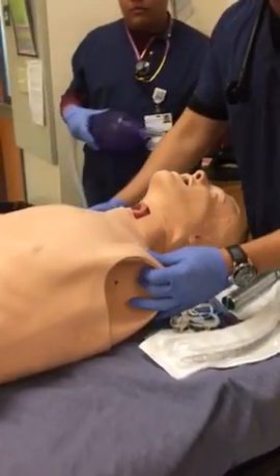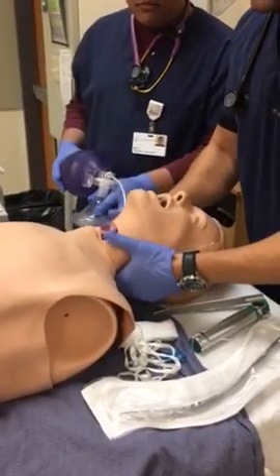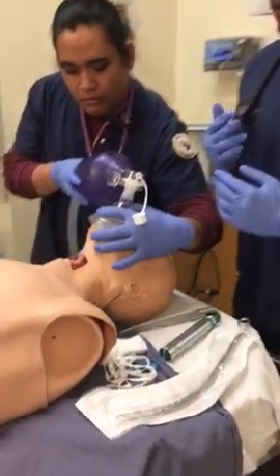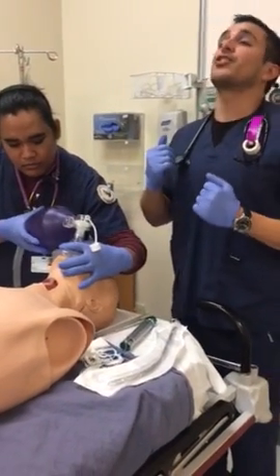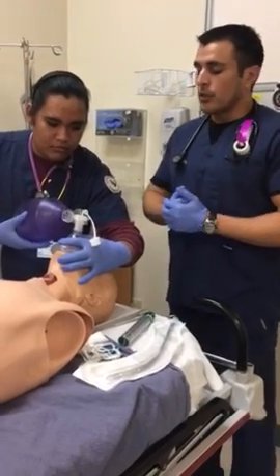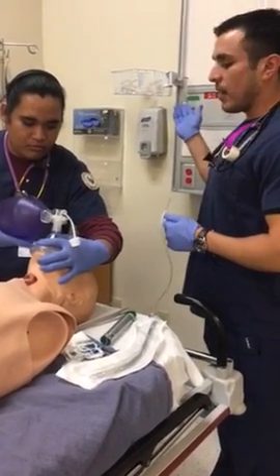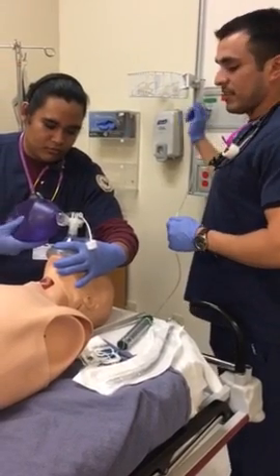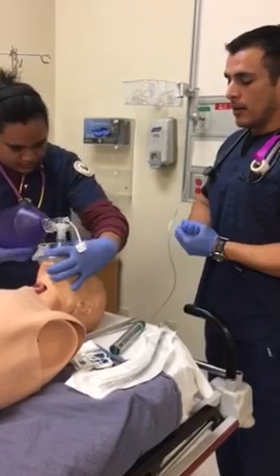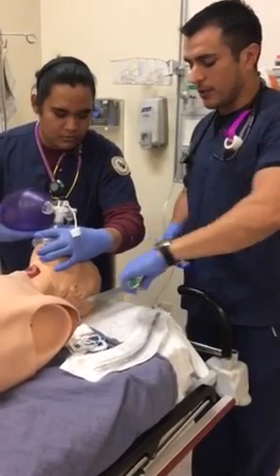So what we would do is we could place a towel maybe under the patient's shoulders if we had to, but we want to get the patient's head back so that they're in a better position for us to get a blade in and actually intubate. Right now my partner is hyperoxygenating. We would be at 100% oxygen. We would just max this out.